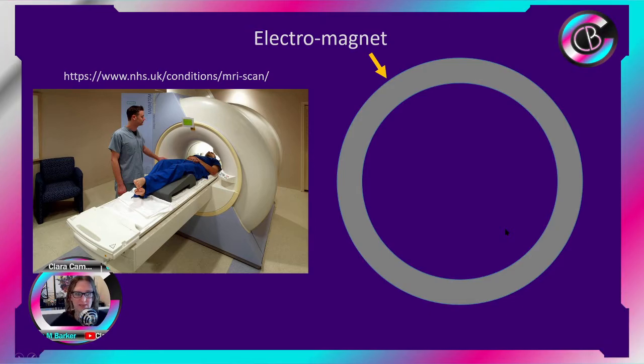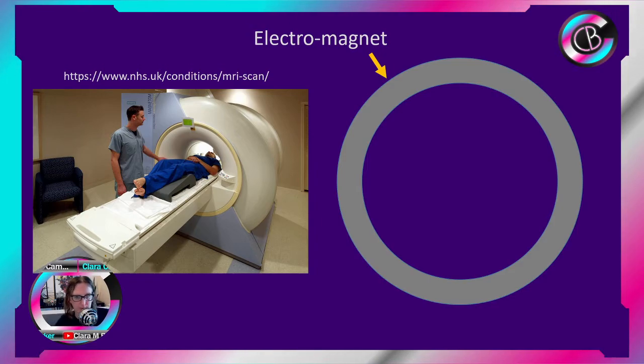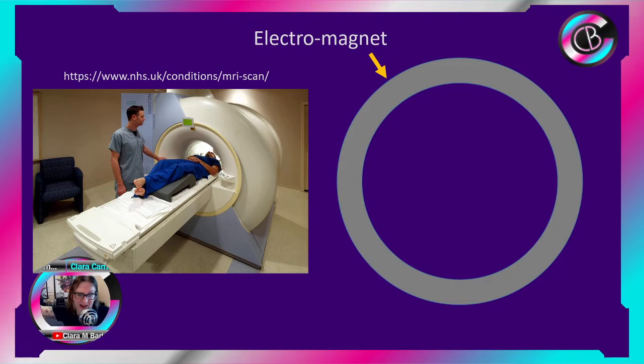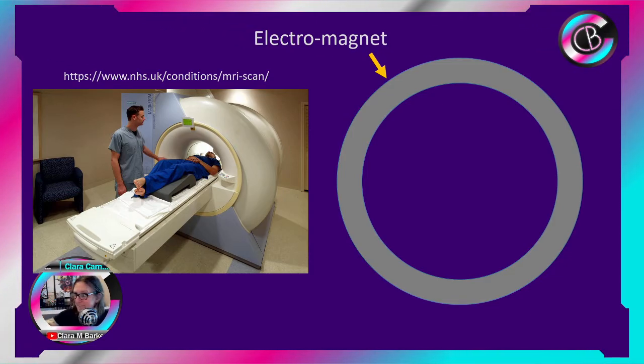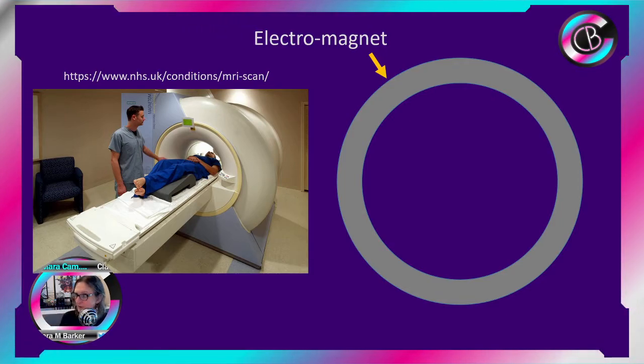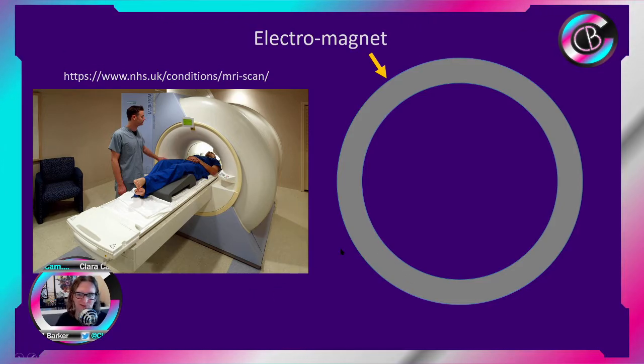What's cool about that is that when they're installed, they're plugged in. You apply the voltage, the current starts to circulate, but then we've got this persistent current thing, which means you can close the circuit, unplug it, and the current carries on traveling around the circuit. So that electromagnet doesn't need to be plugged in during normal operation as long as you keep it cold. The current carries on spinning around and producing an electromagnetic field. That's wicked, right? I think that's cool. You only need to plug them in when you're installing them, or when you've been doing repair or something.